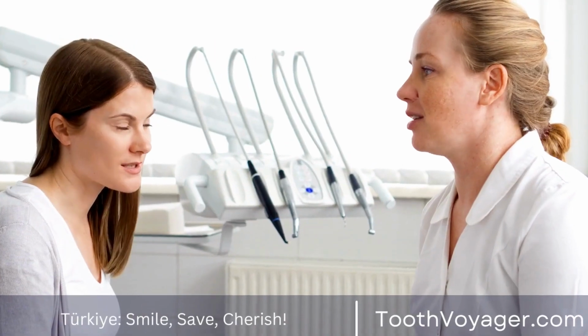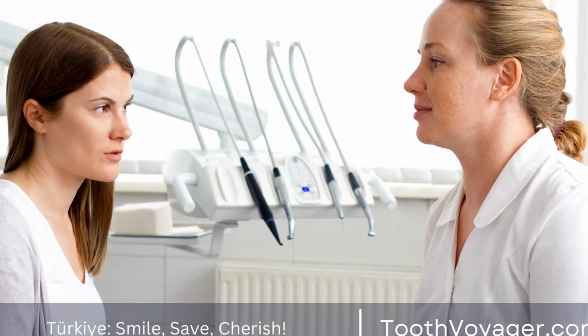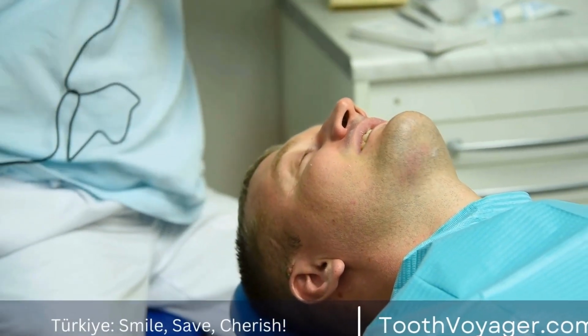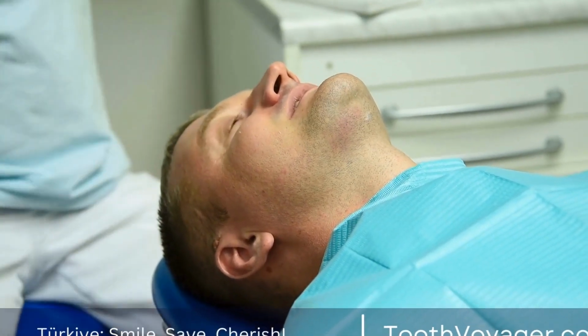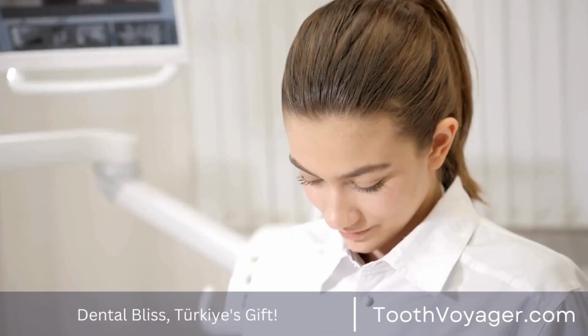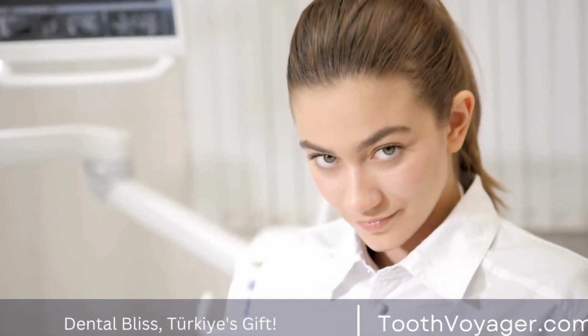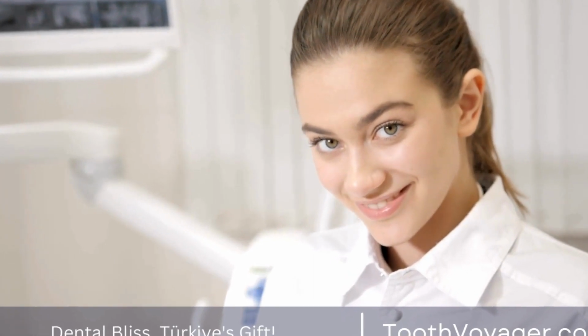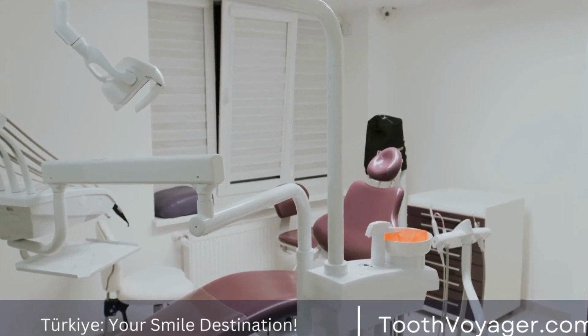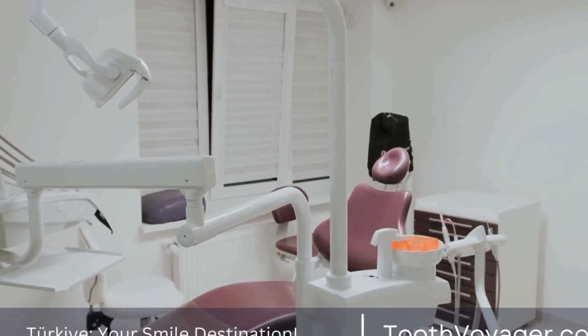This will be sent to a dental lab for a custom-designed crown to be made. In the lab, an experienced dental technician uses the mold to design a customized crown that matches the size, shape, and shade of natural teeth. Technicians will make use of high-end material, like ceramic or porcelain, for a long-lasting as well as natural-looking crown. When the crown is completed, it is returned to the dentist to be placed in its final position.